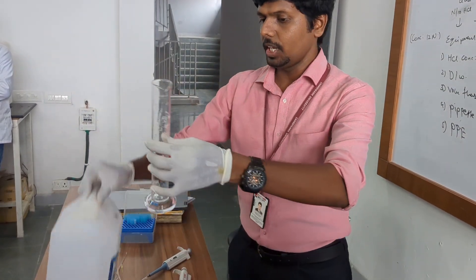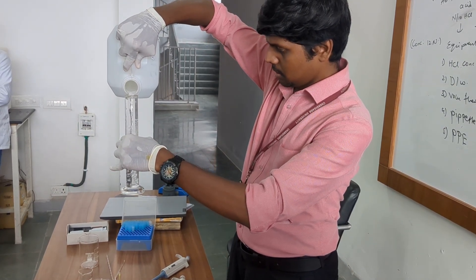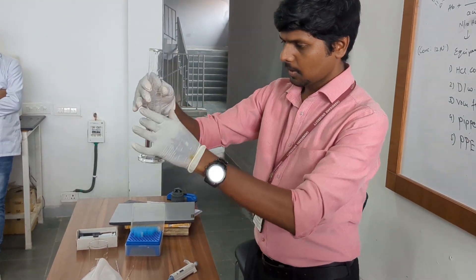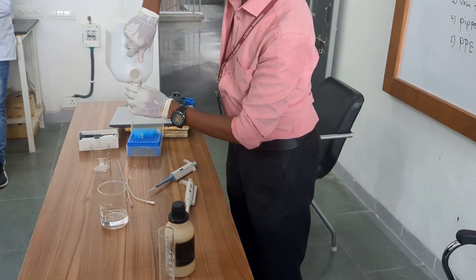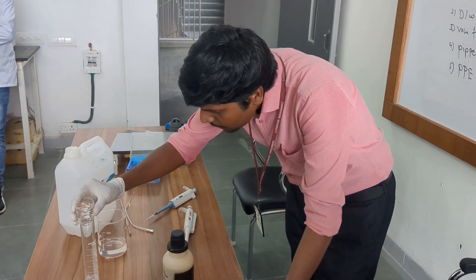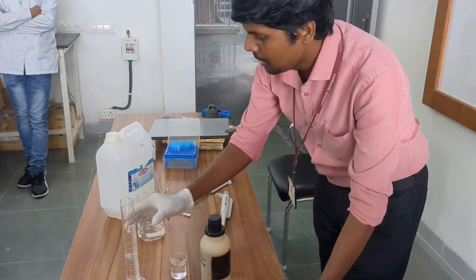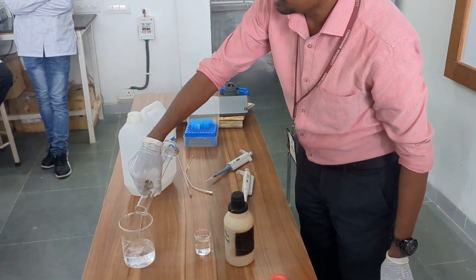I am taking an additional 50 ml, making the total volume 150 ml of distilled water added into the beaker.